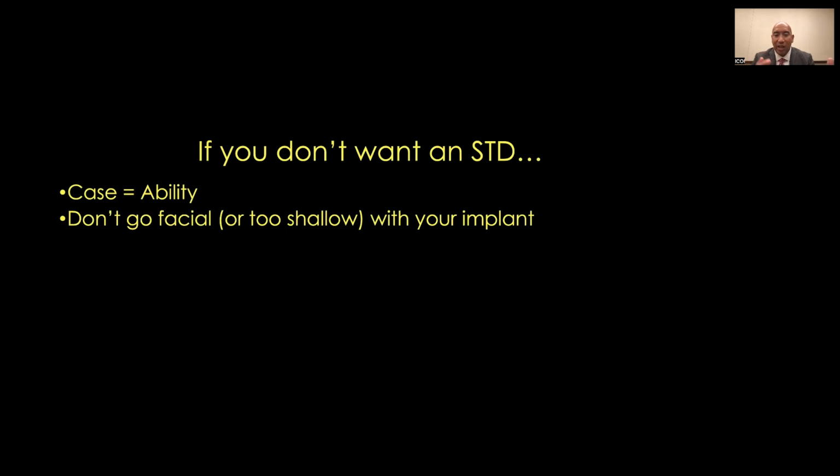So we have a few take-home messages here. The first thing is, if you don't want an STD, a soft tissue dehiscence, you want to choose a case that fits your ability. You don't want to get into these complex cases that are over your head. If it's something that you can do, and you've had good experience and feel good about it, tackle it. But make sure that your case fits your ability.